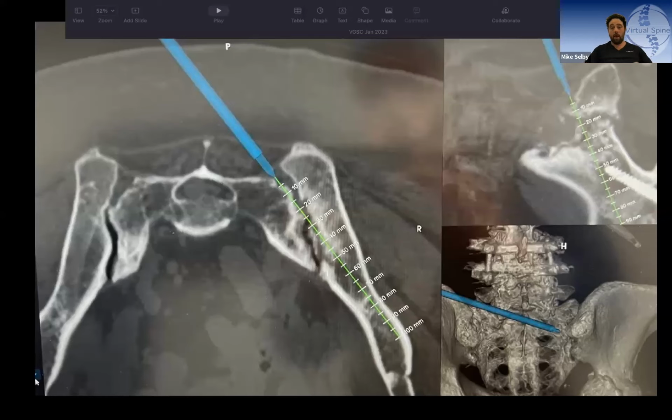And this is the 7D nav in the pelvis. You can see how bad her SI joints are. And so you're running pelvic screws in, S2AI is pretty standard. The thing about this is you can plan where you put the screw heads, so you can actually then get extra screws in.